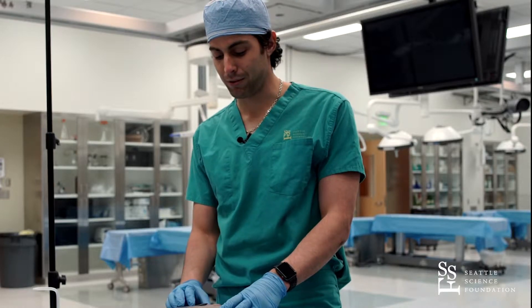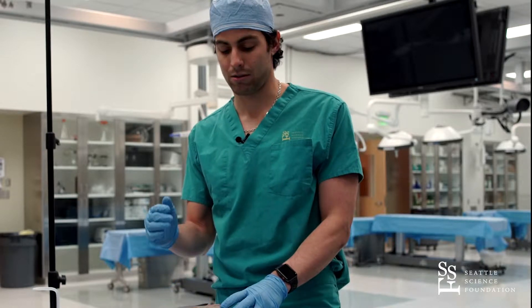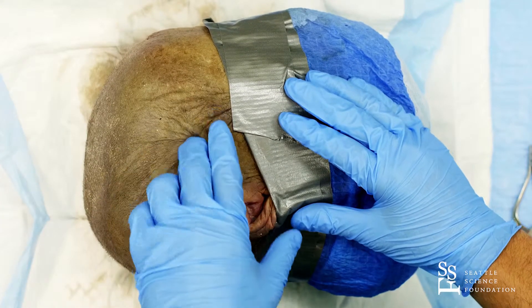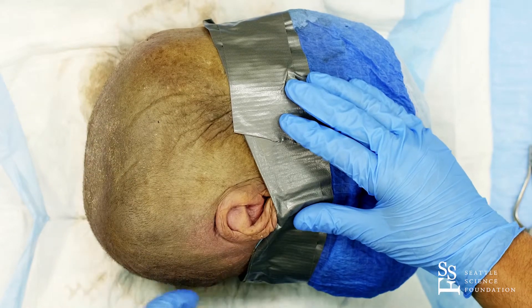Hello, my name is Juan Altafula. I'm a neurosurgical resident from Hospital Santo Tomas, Panama City, Panama, and also an anatomy research fellow here at SSF. Today we are going to learn how to do an emergency burr hole craniotomy and a scalp nerve block.